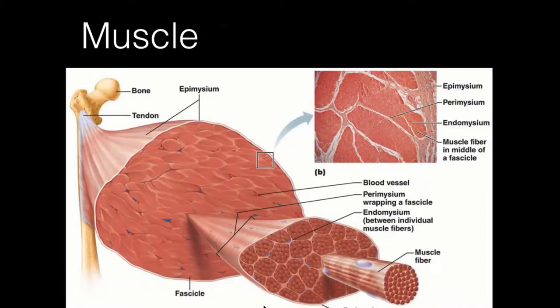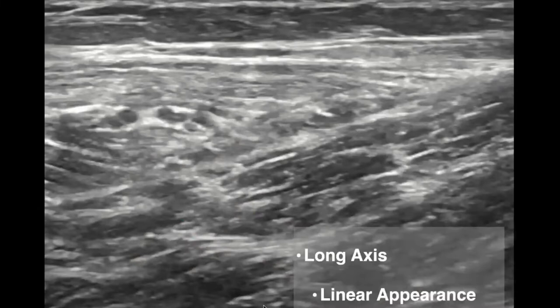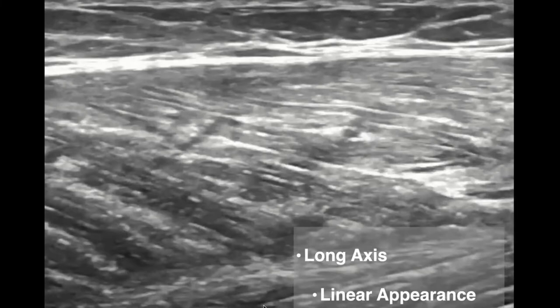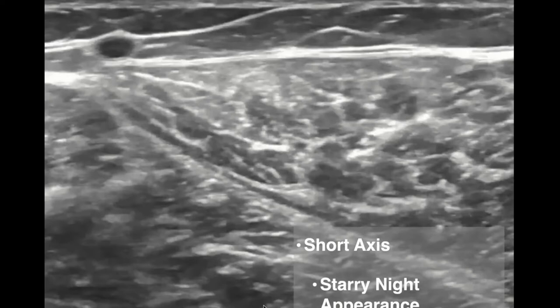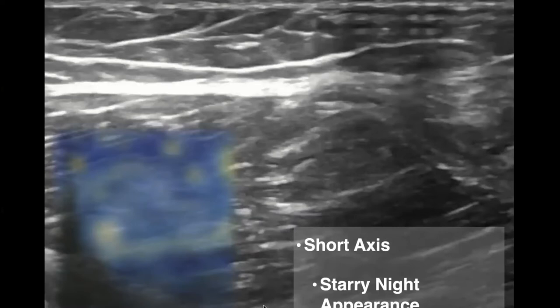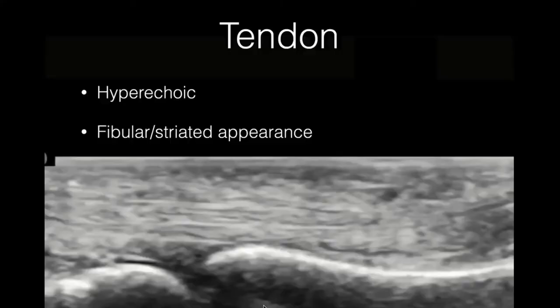Muscles look very different on ultrasound — they kind of look like a nice steak. The muscle fibers are wrapped together to form bundles, which are all wrapped together to make a bigger body. It has a very coarse, linear texture. In long axis you'll see a fibrous appearance — it looks like a nice steak you're going to toss on the grill. In the short axis it has kind of a van Gogh Starry Night appearance — a cross-section of a nicely marbled steak with that starry night-type look.